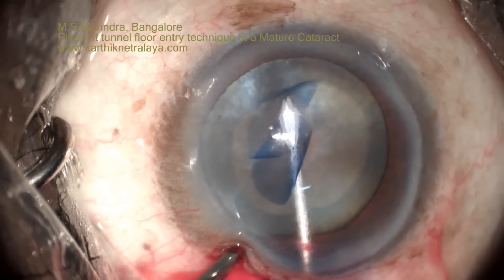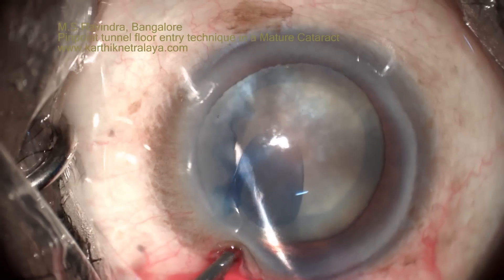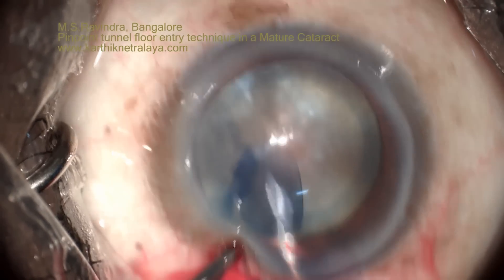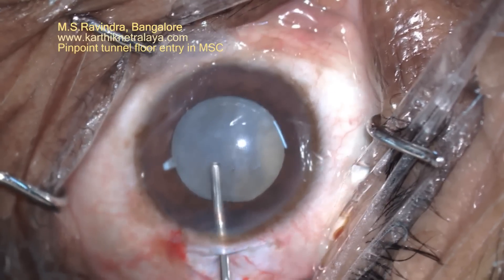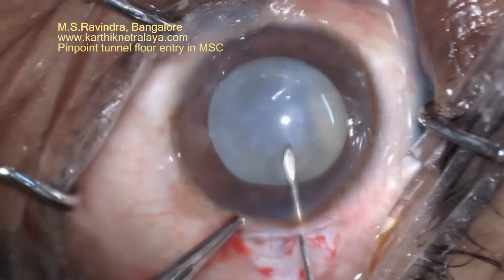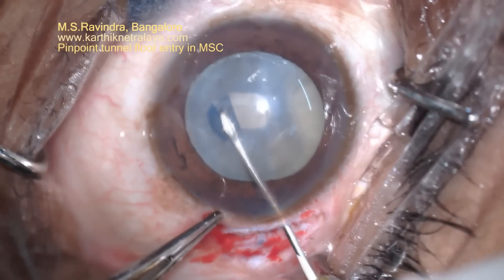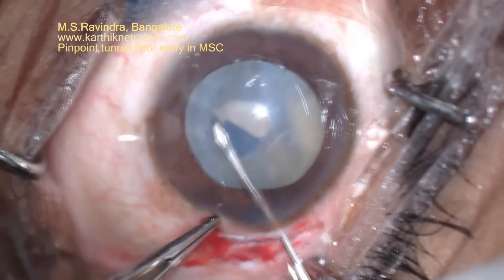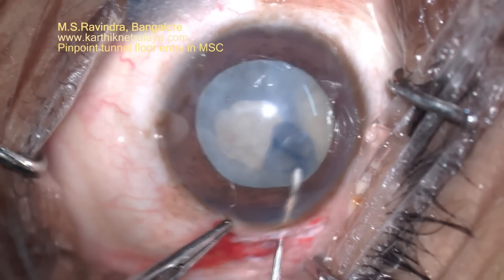This is possible even in cases of extremely shallow chambers, and even in phacomorphic, phacotoxic, or phacoanaphylactic glaucoma where the chamber is hardly present. This is a case of Morgagnian cataract, and again the tunnel floor entry technique is used. Viscoelastic is trapped inside the chamber, and you can still continue to perform a good rhexis in such a scenario.